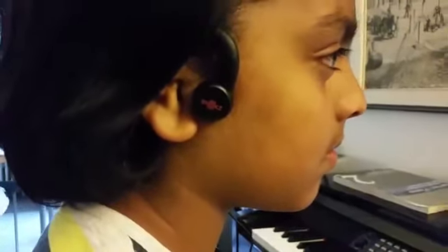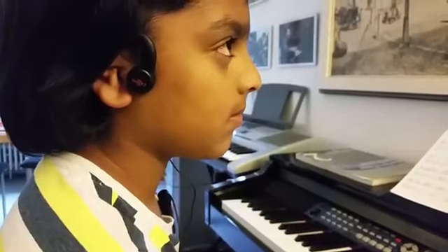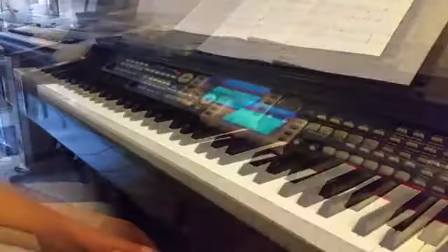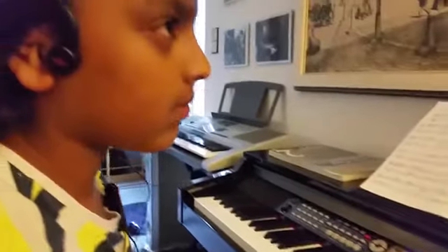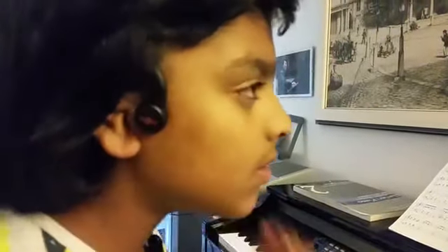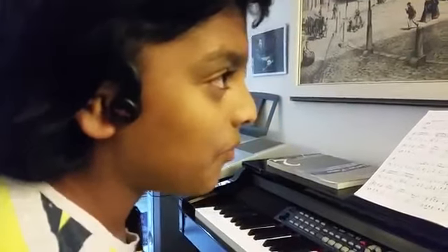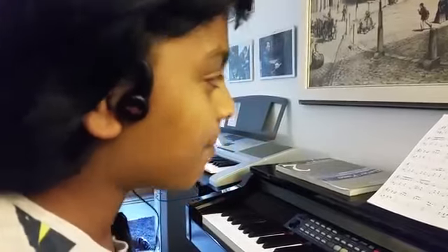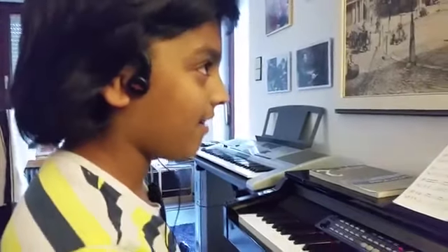So Michelle, you are ready to try your new AfterShokz. You've connected your AfterShokz to your digital piano, and you're going to hear real music for the first time. Are you excited? Yes, I'm really excited. Are you ready to play? I'm ready to play now.